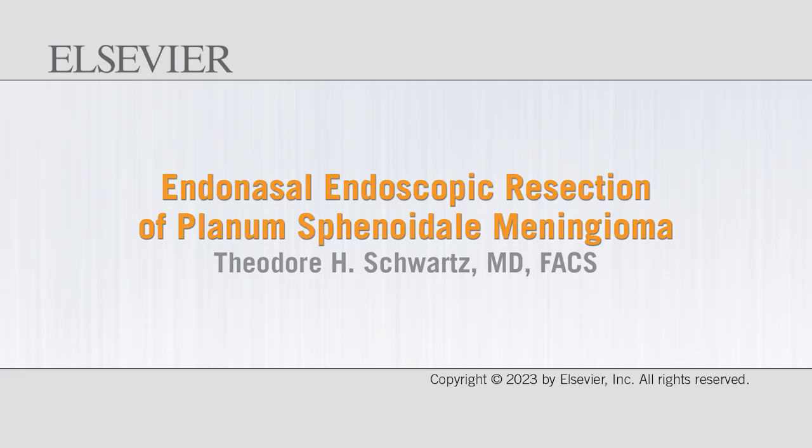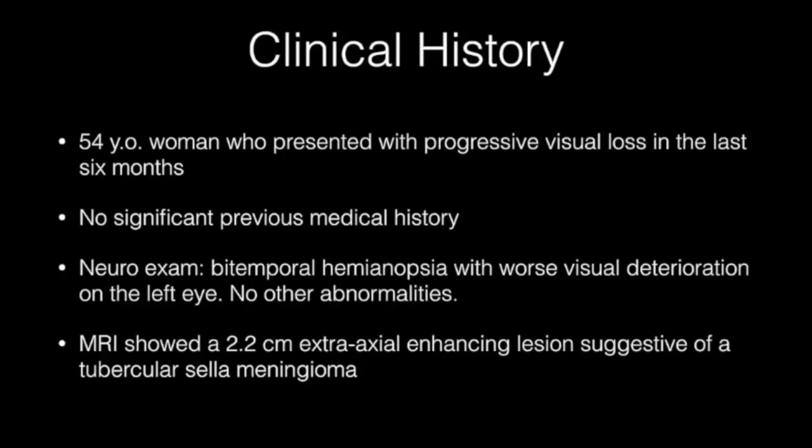This video will document some of the surgical pearls that we have learned in removing a tuberculum sellae meningioma through an extended endonasal endoscopic approach. We're presenting a 54-year-old woman who presented with progressive visual loss over a 6-month period of time.